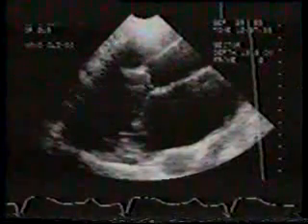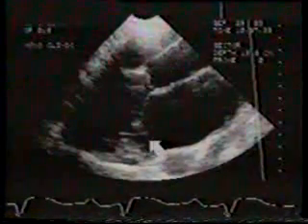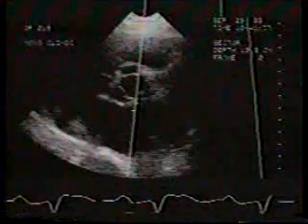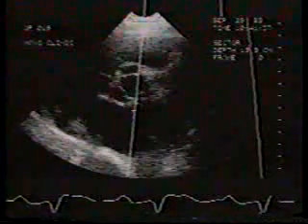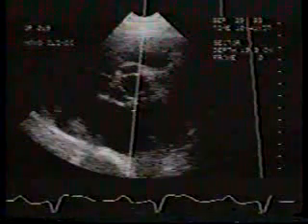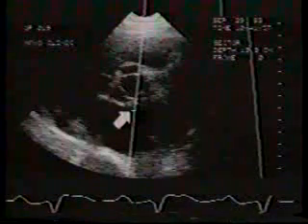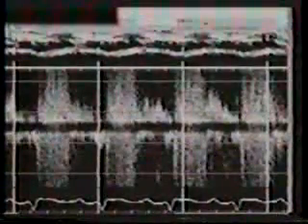This is a peristernal long-axis freeze frame in systole. The posterior leaflet has prolapsed into the left atrium. This is a peristernal short-axis view from the same patient. The examiner, aware of the fact that the posterior leaflet is prolapsing and is likely to baffle its regurgitant jet anteriorly, has placed the sample volume anteriorly in the left atrium, just below the opened aortic valve. The corresponding Doppler display shows the typical aliased signal from mitral regurgitation.